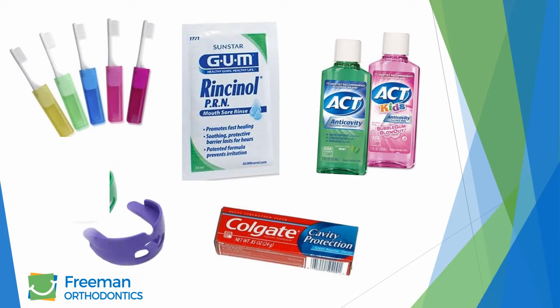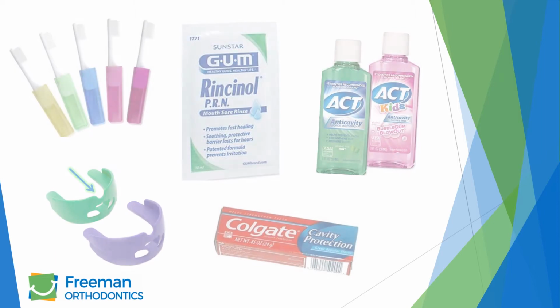Lastly, we have provided you with a mouthguard. We recommend wearing this when playing any high-contact sports. These mouthguards are adjustable as you can trim the ends with scissors. Be sure when placing the mouthguard, the small U-shaped cutout is facing up.